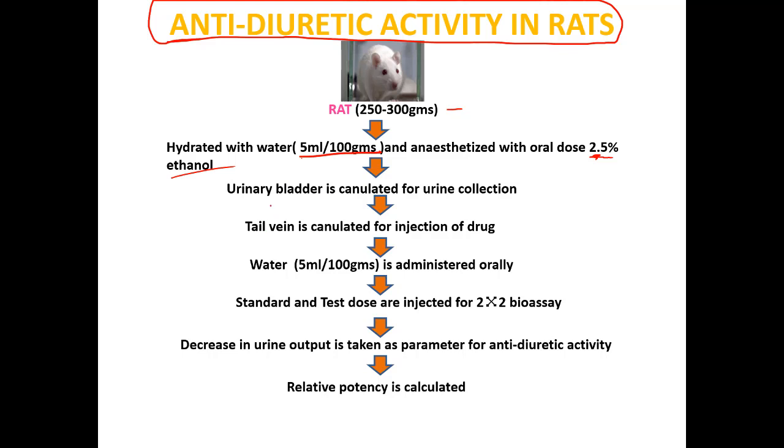Also you have to cannulate the tail vein to inject the drug.